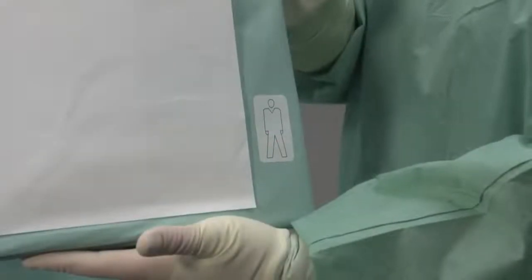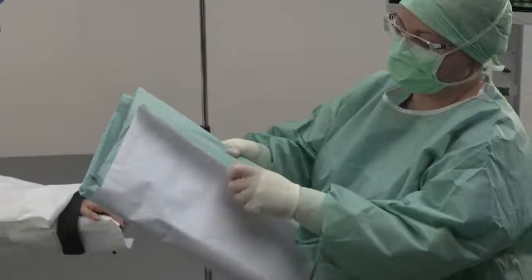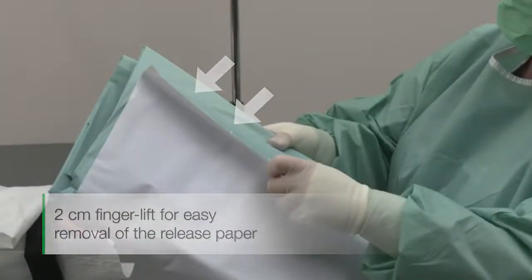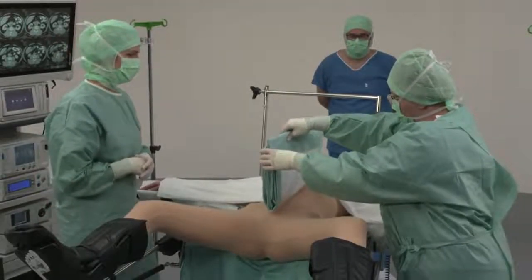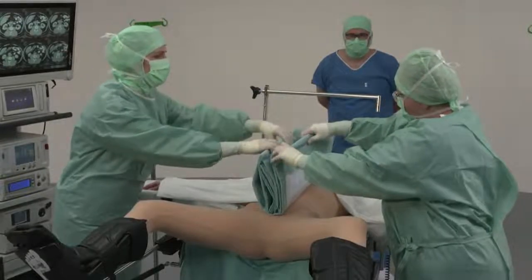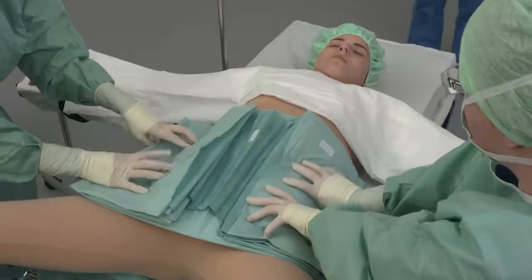Then apply the all-in-one drape. The pictogram shows the position of the drape towards the head and feet. First remove the silicone paper from the adhesive strip. The finger tab is a useful aid. As shown in the pictogram, position the drape like a closed book centrally over the patient's abdomen. Apply and then fix in position.